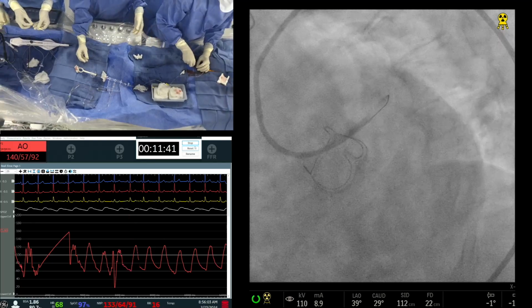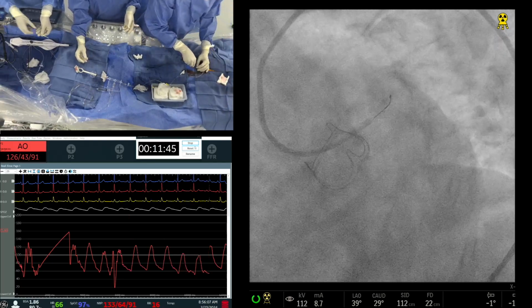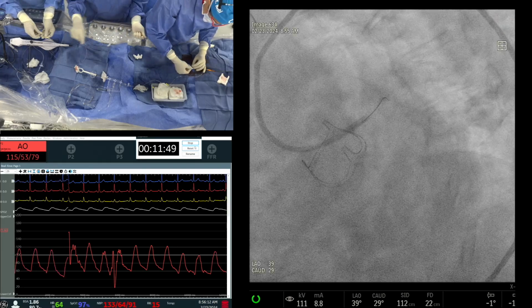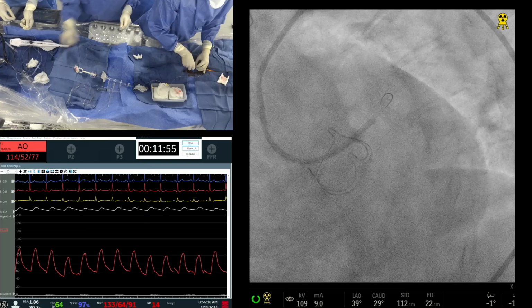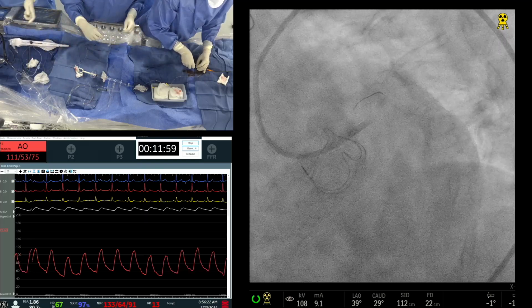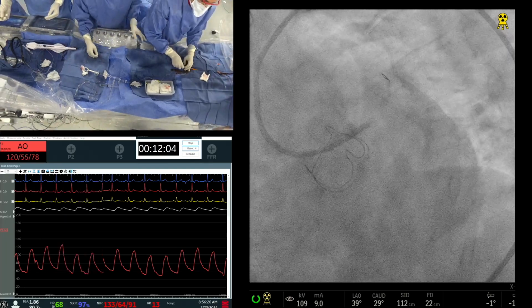Do you want to go to another view, or is it okay? No, I think we are okay. It's just that this is the septal, we know that. I'm trying to see if I can get into the LAD. Otherwise, we get the Fine Cross and change it. So key, I tell everybody, if you cannot get your rota wire in, don't waste time because it may create even more trouble unnecessarily. Use a Fielder, Fine Cross, or whatever over-the-wire system, and exchange it.